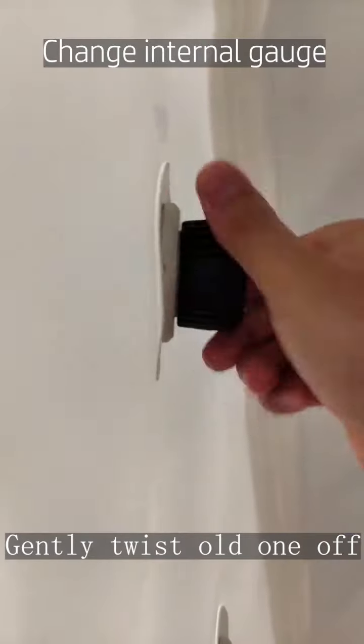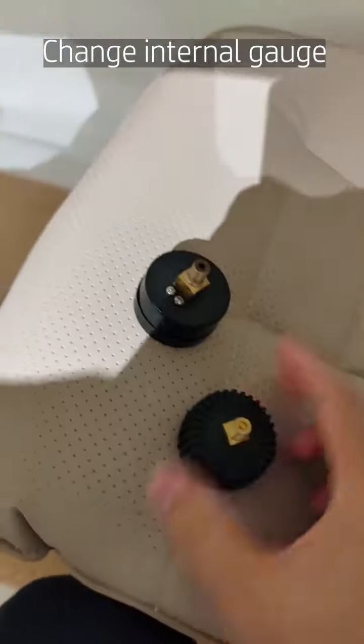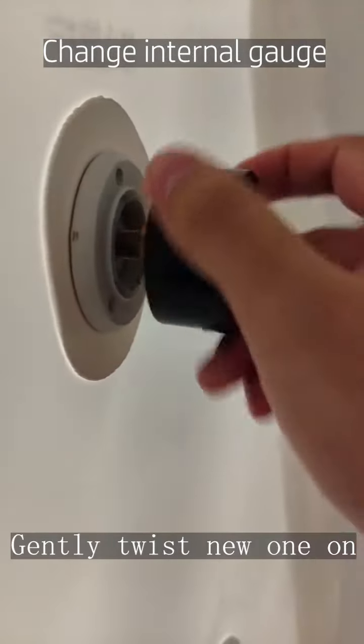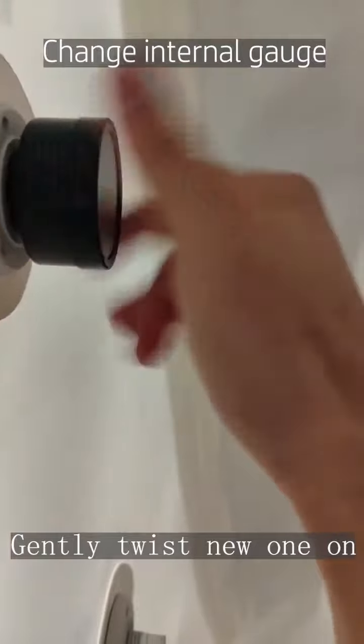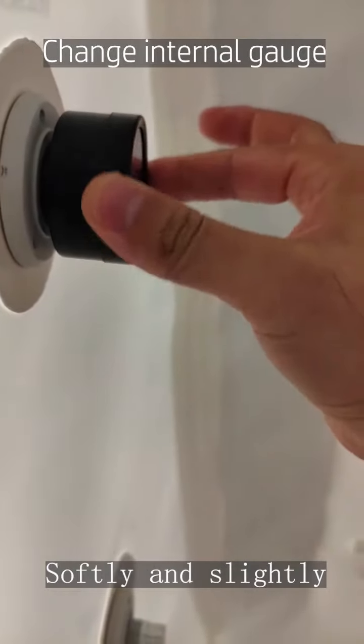Gently twist old one off. Gently twist new one on. Softly and slightly.